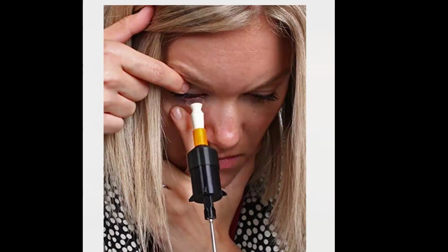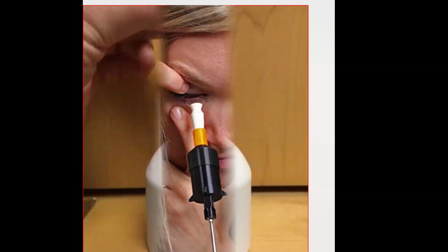Look, the two hands are used to open the eyes, and then gradually bring your face down until the lens is inserted. Remember, be careful. You are not inserting the lens from the center. You are inserting from almost the inferior parts. And with a little blink, with suction, the lens will now fit on the eye.